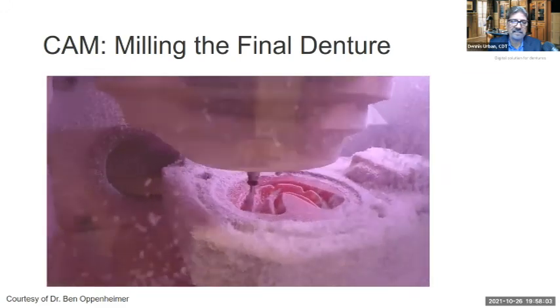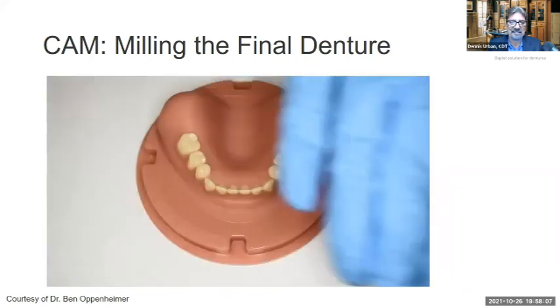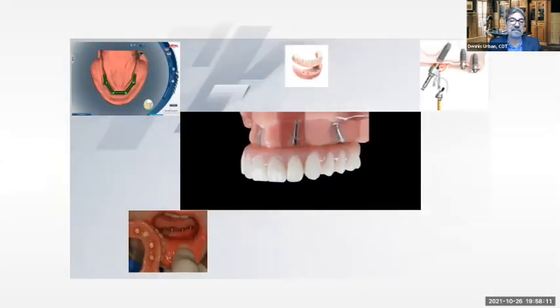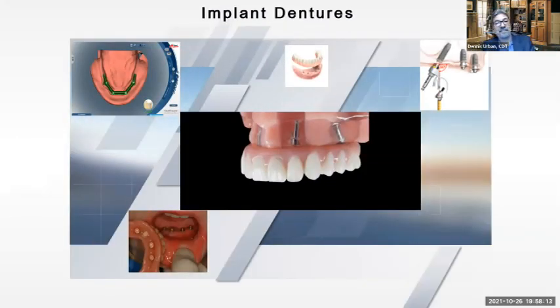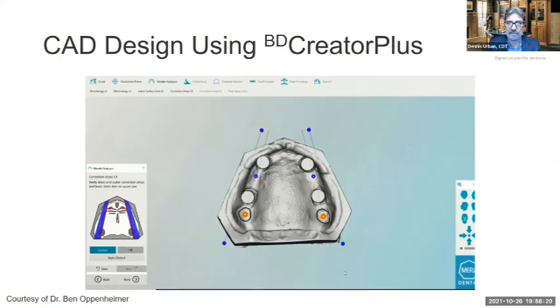So I said, milling takes a lot longer than printing, but there's your nice finished denture. Look at that. Beautiful. Now, this is a great system also. And when it comes to implants, we could utilize digital technology on digital dentures with implant dentures, also using CAD design.